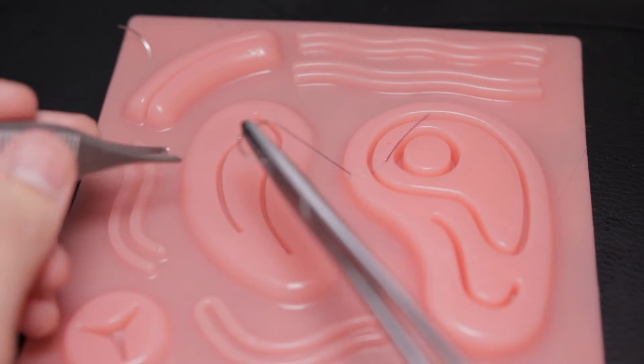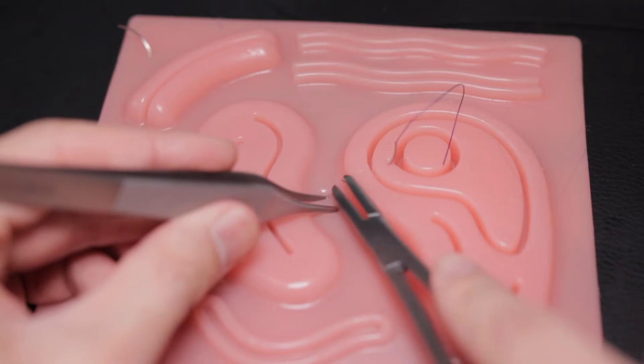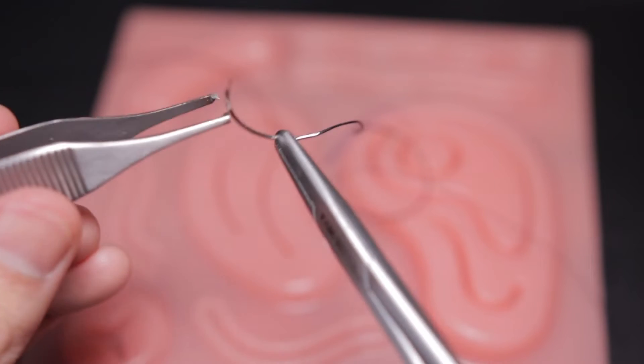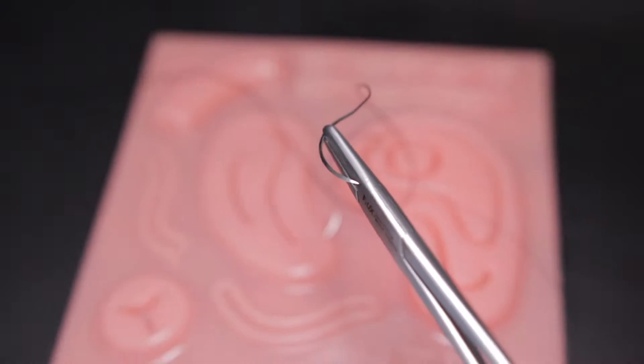Hey everyone, my name is Don. I'm a general surgery resident and welcome to my tutorial on suturing. This tutorial is geared towards learning the basics — if you have no idea how to suture and you need to learn for your surgery rotation in medical school, this is a good place to start. Suturing is one of the fundamental skills expected during your surgery rotation, and it's going to be useful regardless of what you do later on. If you're going into family medicine or doing an emergency rotation, you're probably going to have to suture some small cuts in the ER, so it's really useful to know how to handle needles and do the basics.